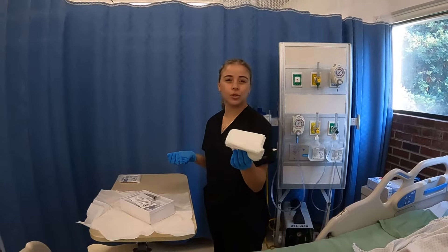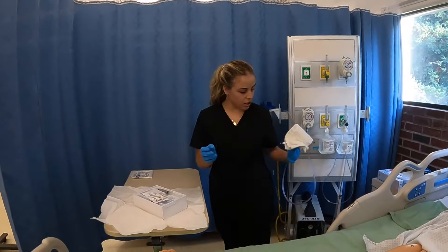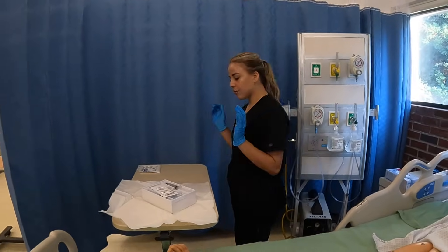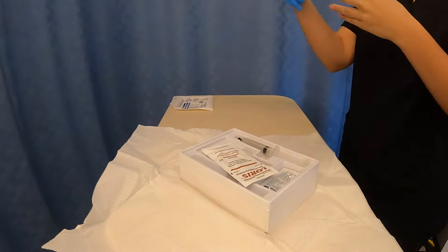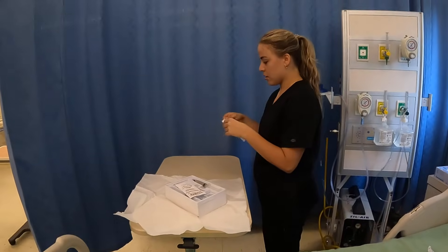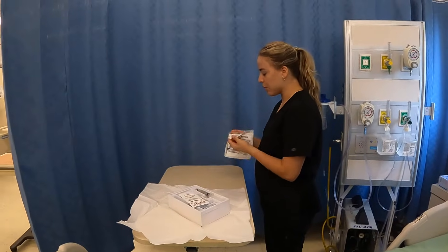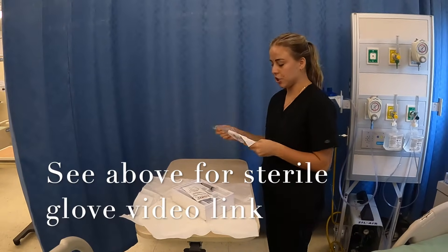This is the fenestrated drape. You could choose to use this on your patient or not — I personally don't, so I'm just going to throw it away. Now from here, I'm going to take off my regular gloves, throw them away, and get my sterile gloves. I want to emphasize that when putting on sterile gloves, you want to make sure that both sterile fields don't touch each other.